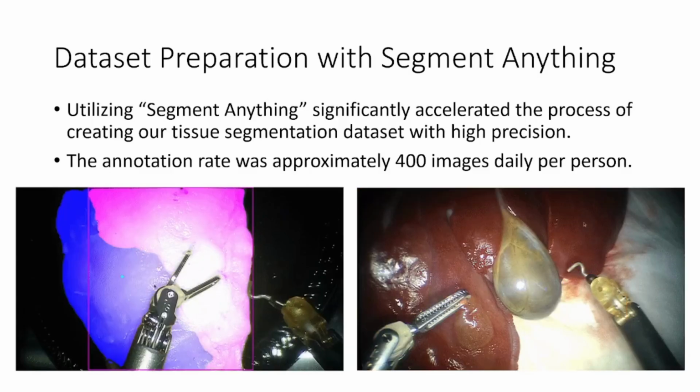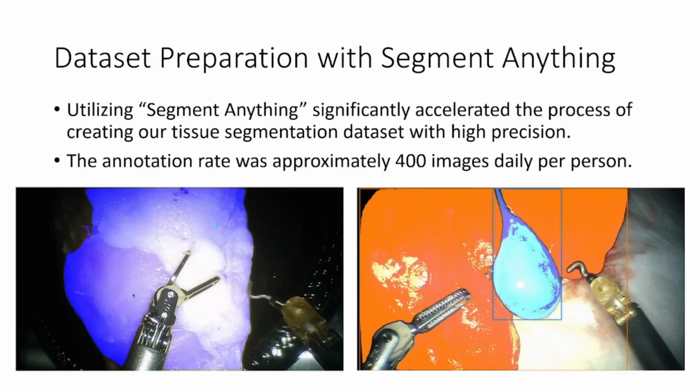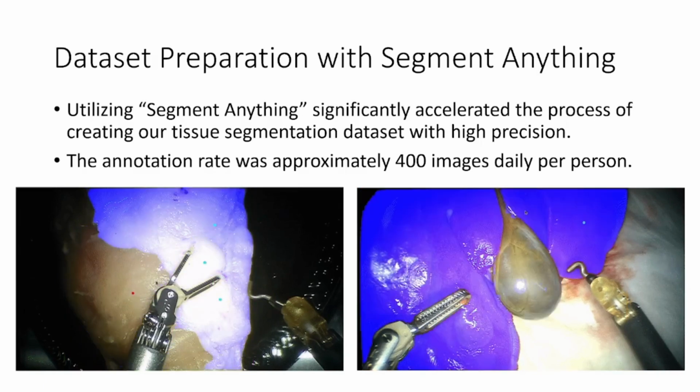Utilizing Segment Anything, we've accelerated the labeling process, achieving 400 annotations daily per person. These samples demonstrate the speed and the precision on both chicken and liver specimens.